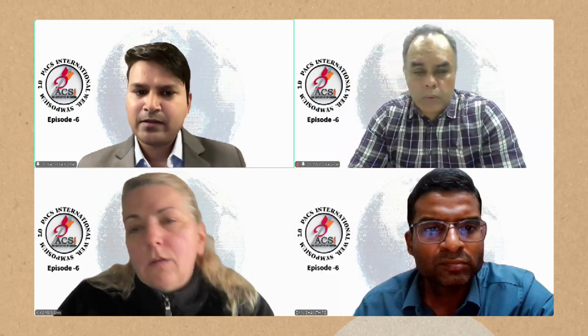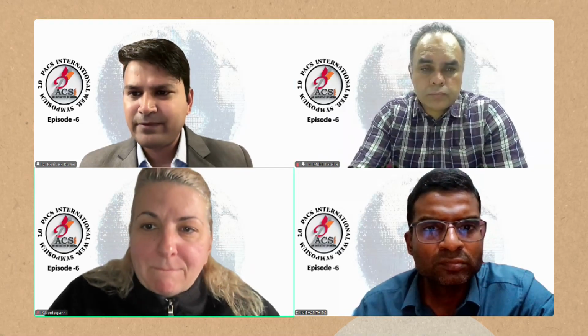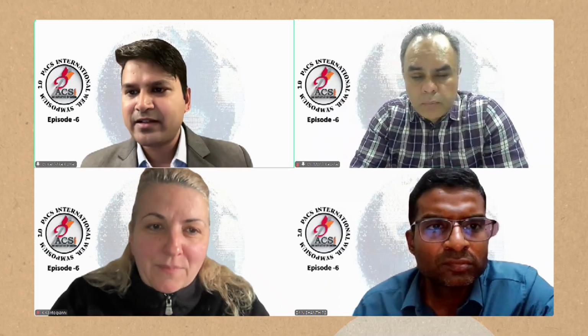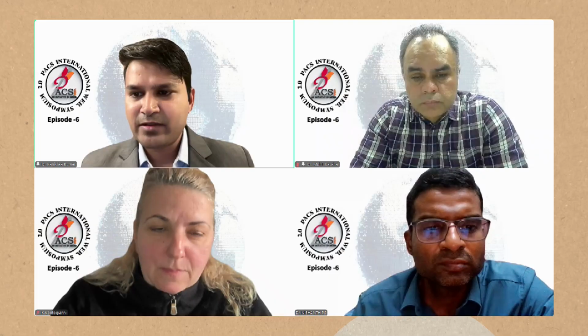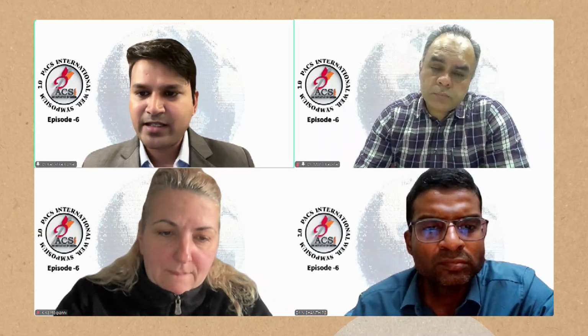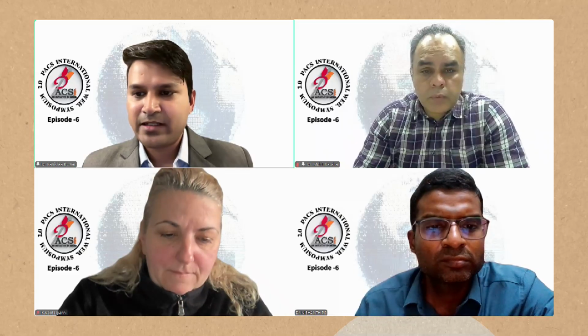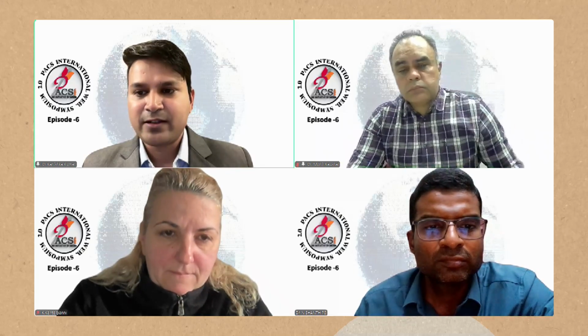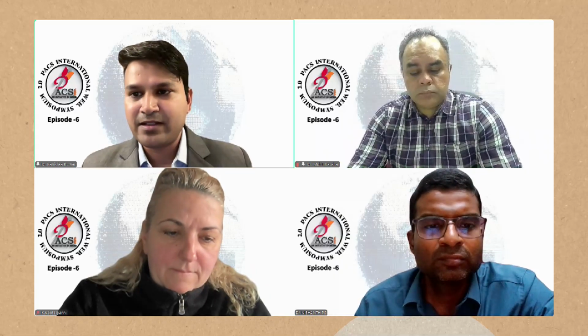Thank you, ma'am. There was one question: if it is necessary and high risk, should we go ahead with the rigid? Ma'am has already answered that. In my opinion, yes, with rigid we have a secured airway the whole time, and an anesthetist is there who takes care of the patient. So of course, rigid is preferable when you think it's necessary and high risk.